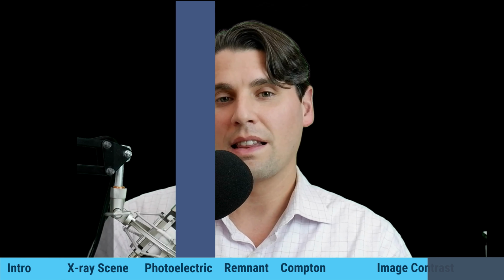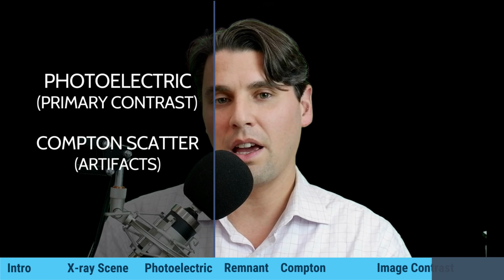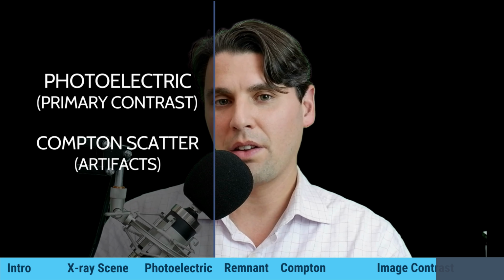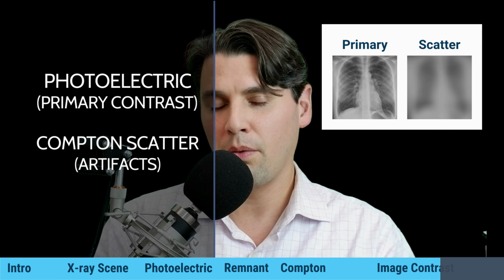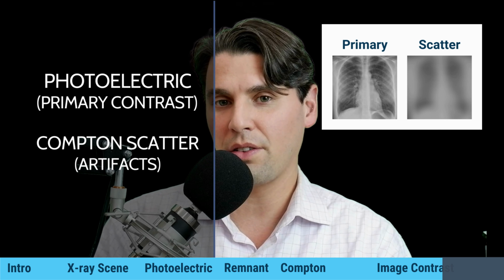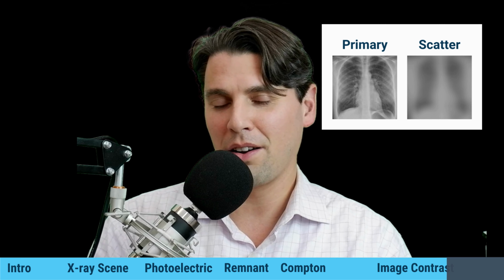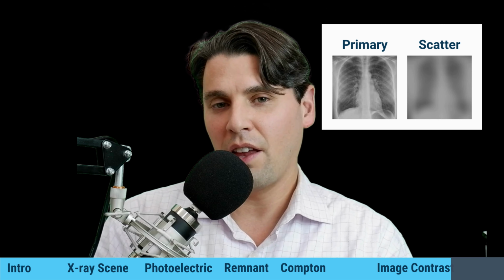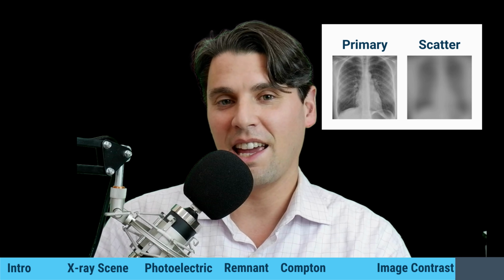And then scatter, like we talked about, leads to artifacts in our X-ray images, namely an overall haze in the background of the X-ray image, because those scattered photons end up going mostly forward in the direction of the detector, but they're not going exactly where we would predict them to go. So in that case, it'll end up leading to an overall blurring or background haze in our X-ray images.